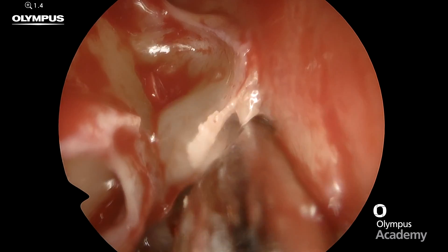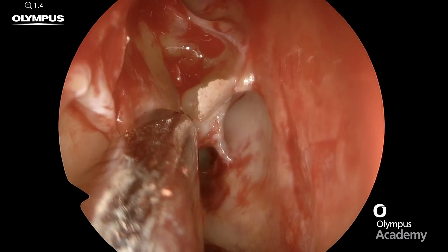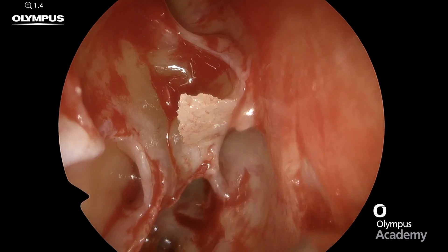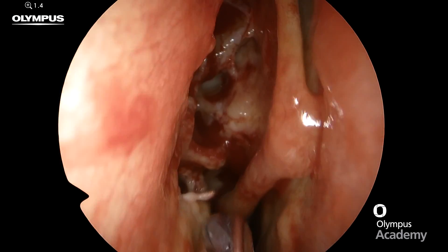One last little area to remove and then expose the whole of the ground lamella of the middle turbinate, before we move on to penetrate the ground lamella and proceed to the posterior ethmoidectomy if required.